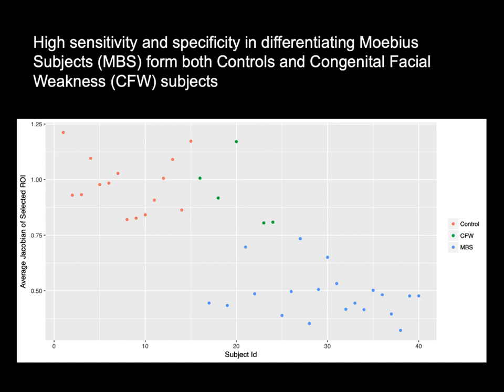If you need to analyze these differences based on a group of subjects that you would include in the analysis, then you risk being biased if you just choose a template built from the controls. So we tend to do a population template, and then we do the statistics: each subject goes into the population template, and that will be a sort of common ground between patients and controls.